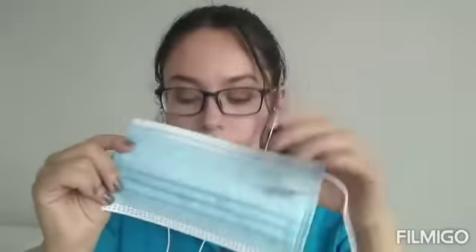Now we are going to do some different experiments. If you want to know the quality of your mask, you can also try these experiments. Our first test is the electrostatic test. What you need are some scraps of paper, which I have here, and a mask like this one. What you basically do is place the mask on top of the scraps of paper.